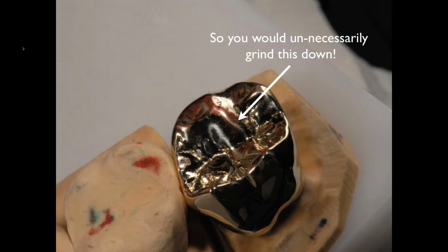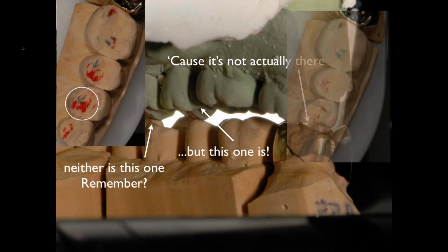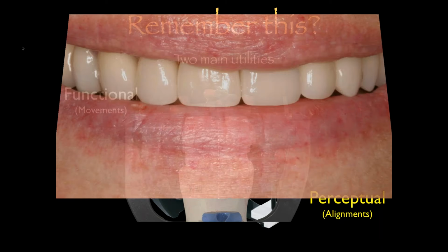It's kind of a shame, because if we look at the real situation of the mouth on a real articulator, we notice, oh, that balancing interference wasn't even close to being there. Okay, we don't have that. This one is there. We saw it before. It's a very minor balancing interference, which the patient obviously has because we're at 60 and we still have it, right? And we end up grinding that tooth down unnecessarily, that crown unnecessarily, which makes it less pretty, okay?